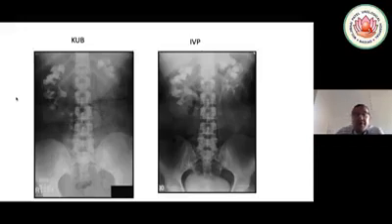And then I will start with the first. Usually I start from the calyx where the majority of the stone is. So my first dilation would be in the upper calyx. Remember, this is maybe an advantage of supine PCNL for upper pole puncture, because when the kidney is so high, in prone, you do the puncture much more posterior, so you have more problem of interposition of the liver. Instead, in supine, going from the flank, usually you can have more room to stay behind the liver just to reach the upper calyx. This is another little advantage.